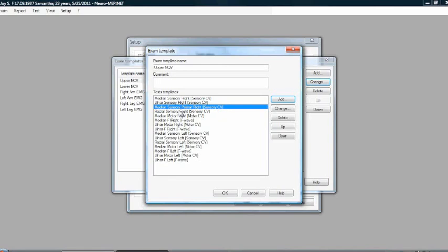If you don't like it to be above, if you want it to be below the radial or above the ulnar sensory, so you do the median at both times, you just click this button up here. It goes up here. So now each time I press test next, you're going to have median sensory right, median sensory palmar right, and then ulnar sensory, and then radial sensory. So you get the idea.